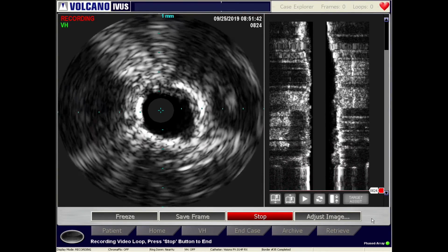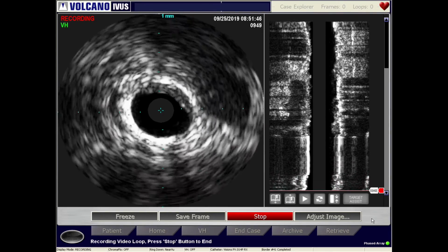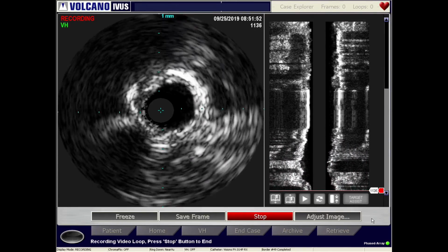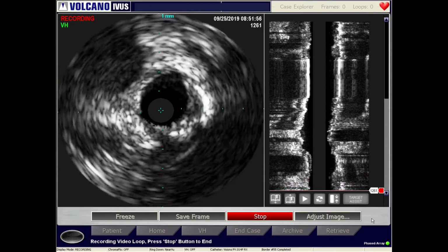And they're obviously interesting. We're very intraluminal all the way down, right? The plaque is very minimal at this level, or we pushed it aside nicely. And now we're getting into the pop. I'm fluoroing here, not yet quite in the pop, still the posterior tibial.